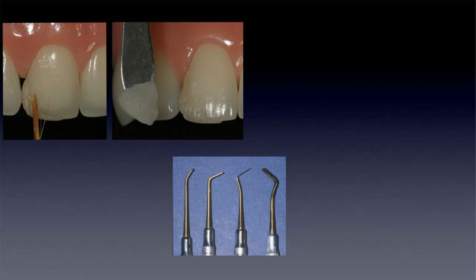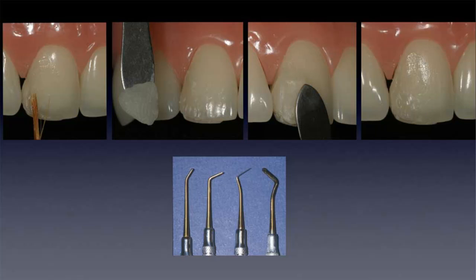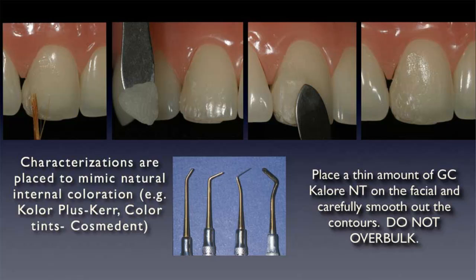Here's another critical step: using this brush. I would urge you all to get an artist brush because this will save you 20 minutes of clinical time in shaping your final external contour before you do the final curing of the surface. Okay, very, very important in order for you to be able to shape this using an artist brush.